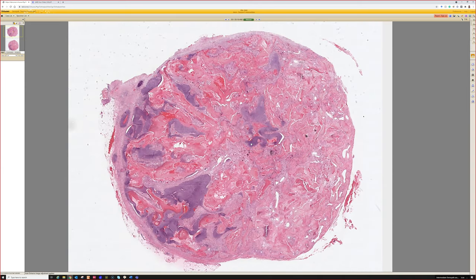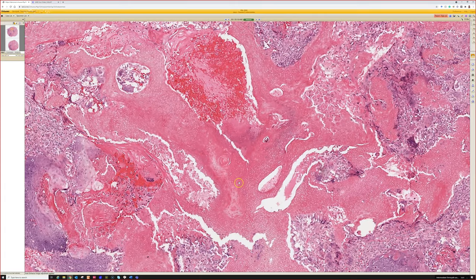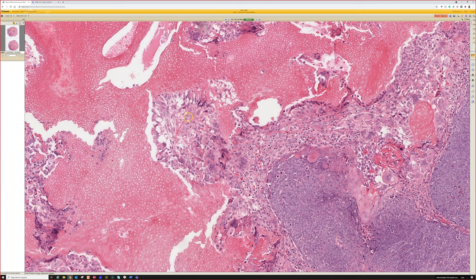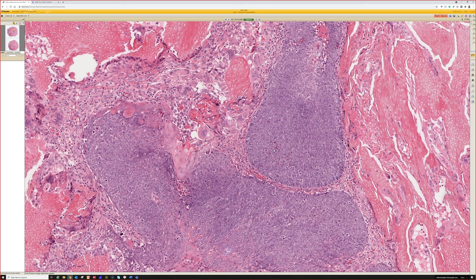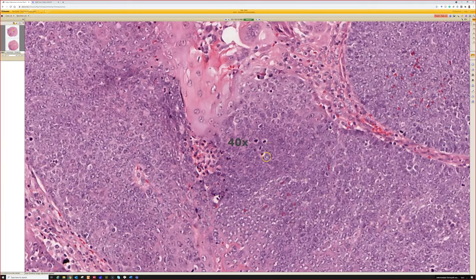Another textbook example. What's this one? Yeah, pilomatricoma or pilomatrixoma, whichever you like. I like how the X looks, but it's easier to say pilomatricoma. And it's a mixture of these ghost cells or shadow cells, which are just the washed out sheets of dead keratinocytes. This dead keratin incites a massive granulomatous reaction with giant cells and histiocytes, which are usually present. And then if you are lucky, you'll see islands of blue basaloid cells. These can be totally absent or they can be abundant. It just depends on the case. And the basaloid cells can be very mitotically active.